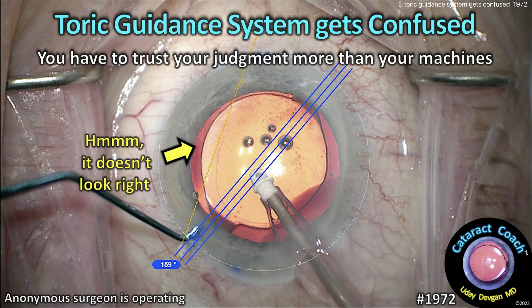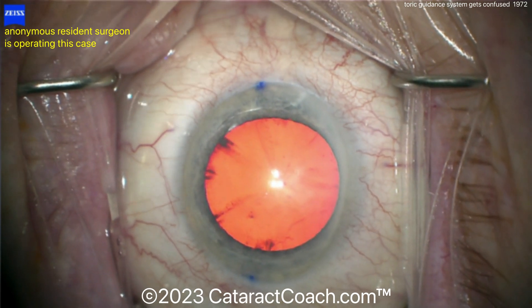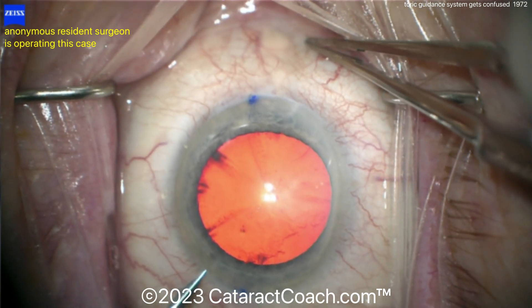CataractCoach.com. The toric guidance system gets confused. You have to always trust your judgment more than your machines. Here's the beginning of the case. In all fairness, look at the two ink marks on the cornea — they're supposed to be at the 180 meridian, but they're not 180 apart. So already something's a little bit funny there.